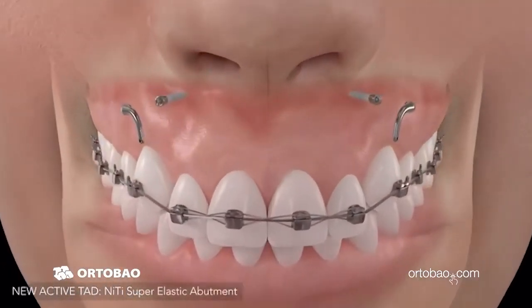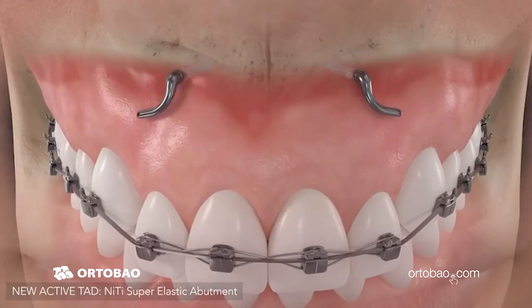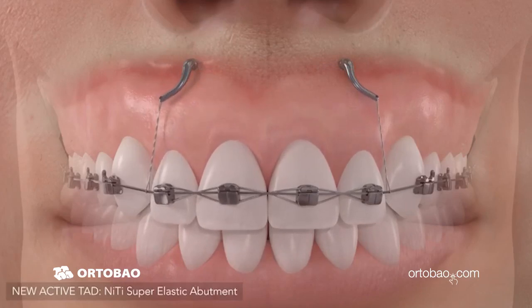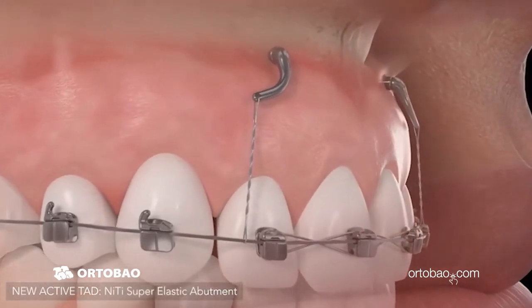The same will happen with intrusion. If we want to intrude an anterior segment, then we can have V-shaped active abutments, and those V-shaped active abutments will be activated by means of flattening their shape, but when they are heated, they will move the anterior segment easily, without the need to change the elastic chain that normally suffers creeping, deformation and loss of power. So now this is an active abutment for TADs, and I hope you like it.